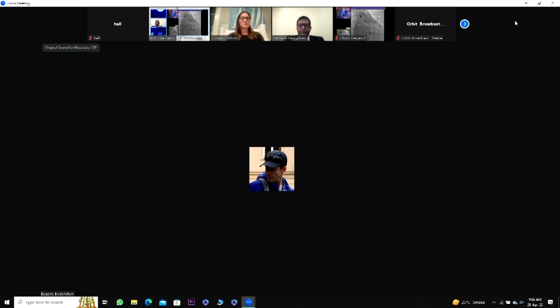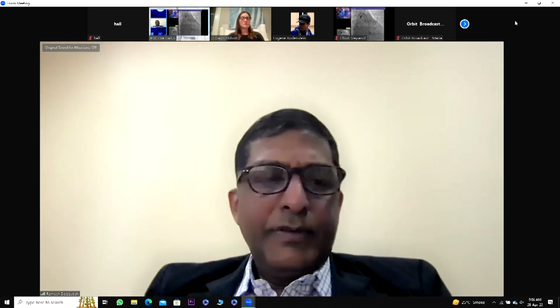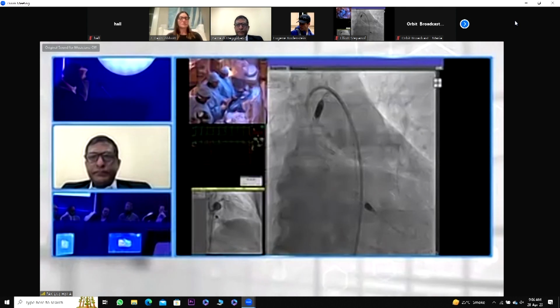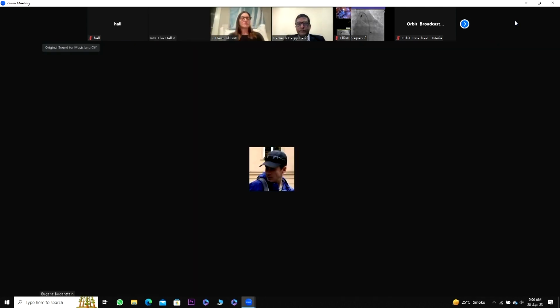I think we checked it early on, and we haven't checked it again. 286 is what it was. Yeah, that's one advantage of using Angiomax. Once you've achieved it, you don't really need to check it. We use heparin most of the time, so in Pakistan we have to. So we're going to pot with a 5.0, and then we'll recross for our KISS.